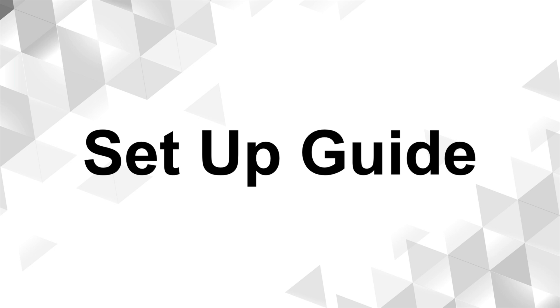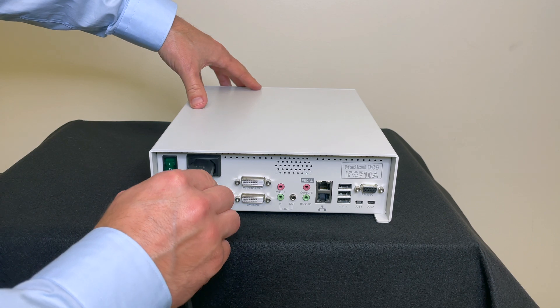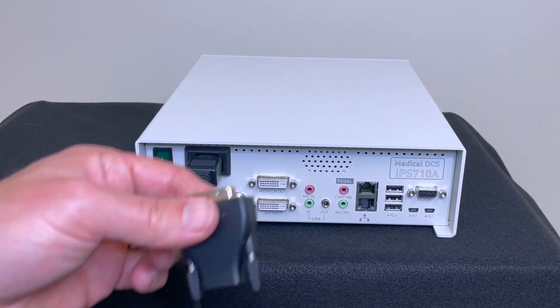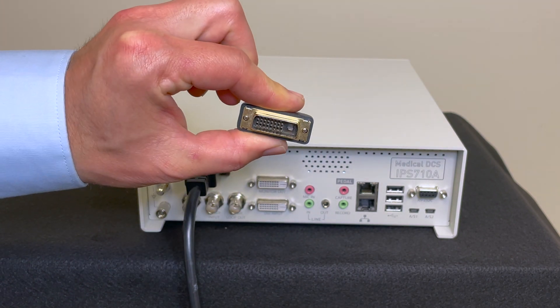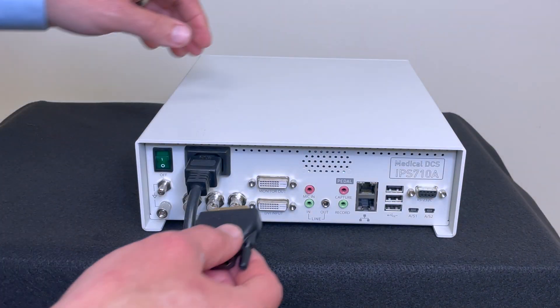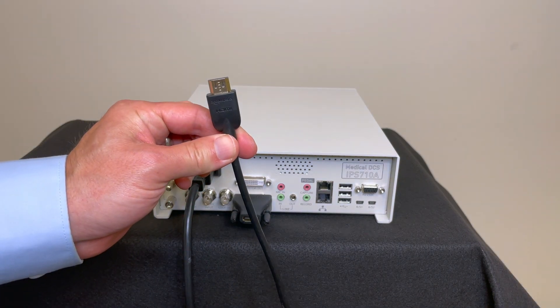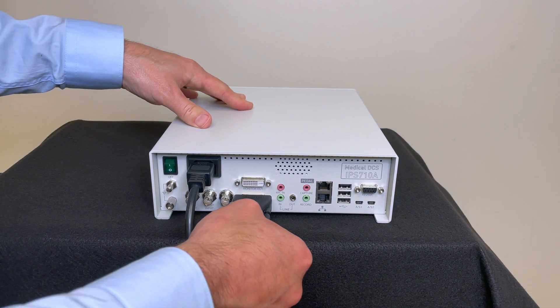I will describe the connections from left to right. First, add the power cable to the recorder and plug it into the power outlet. Next, you will see there are two DVI inputs — one is for the optional external monitor and the other is for the incoming recordable video source. If you are running HDMI cables, simply add an HDMI to DVI adapter.